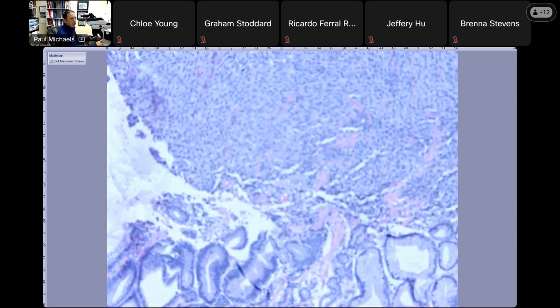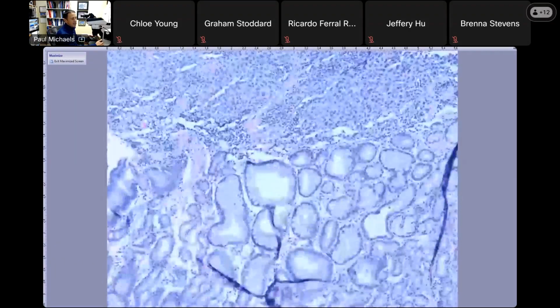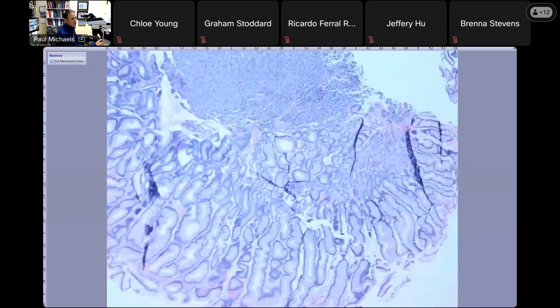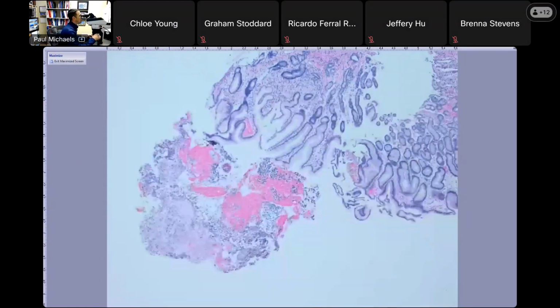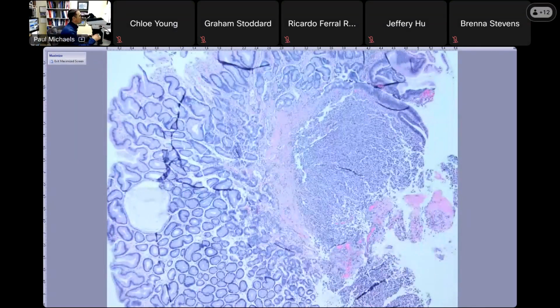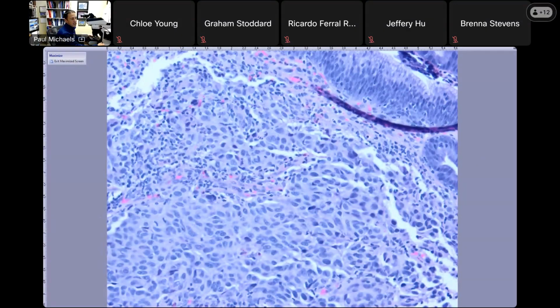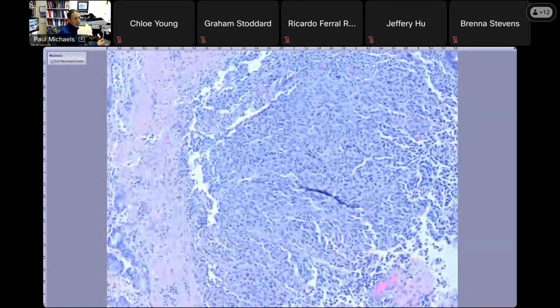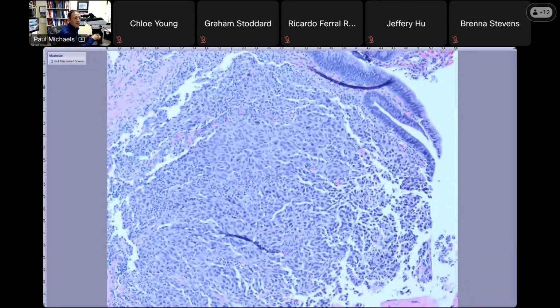So this is epithelioid, spindled, in like the base of this mucosa, normal gastric mucosa, kind of has a reactive gastropathy appearance, this corkscrew, but clearly what's going on is what's underneath here. So it does not look like it's involving the surface mucosa, or I mean it is, but it's not mucosal based, I should say. So epithelioid to spindled malignancy in the stomach. I think GIST is reasonable in the differential. Also metastases, melanoma, neuroendocrine tumors.